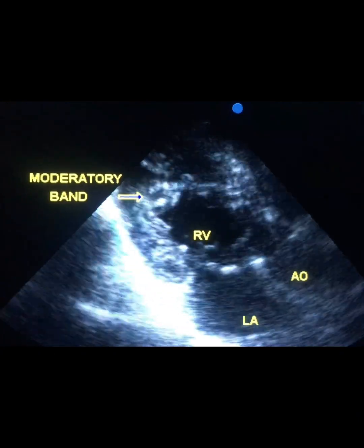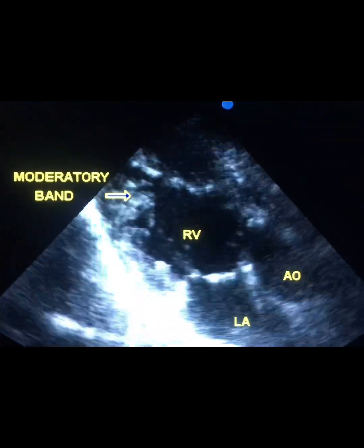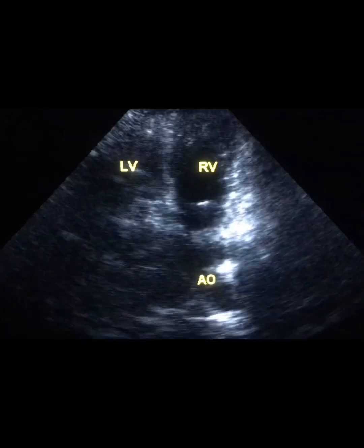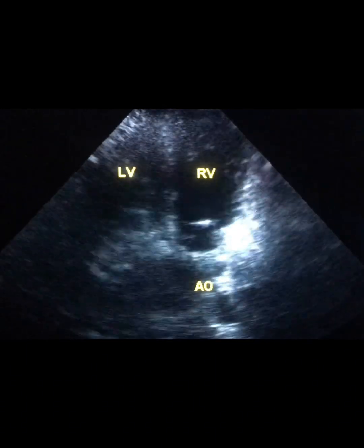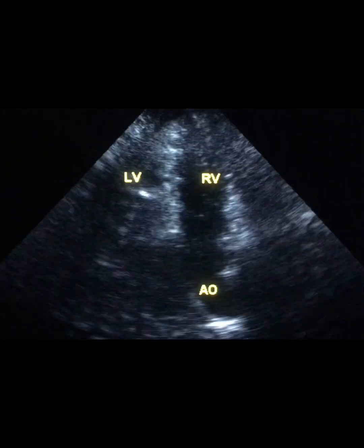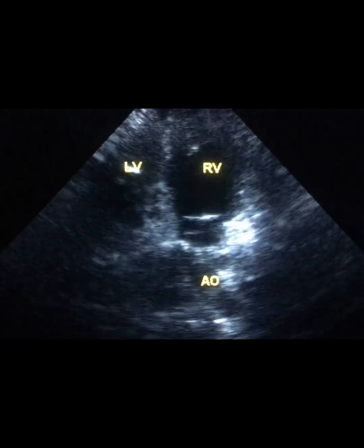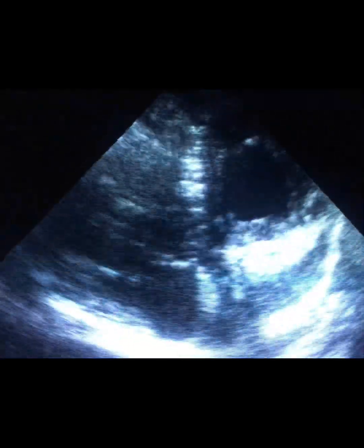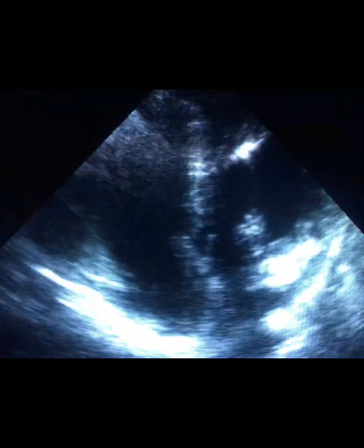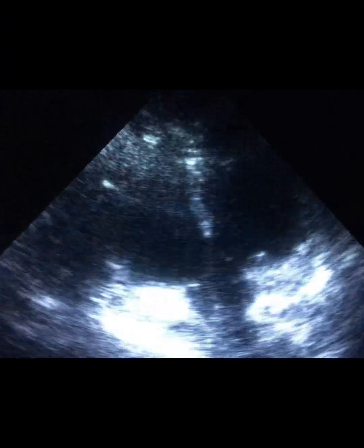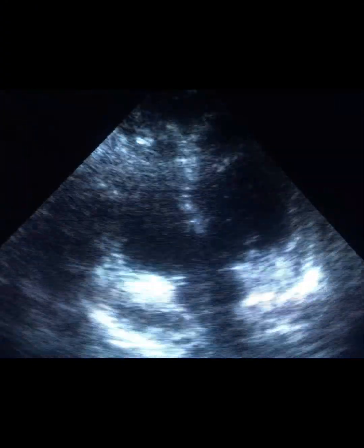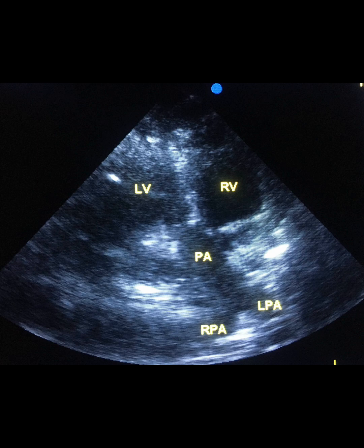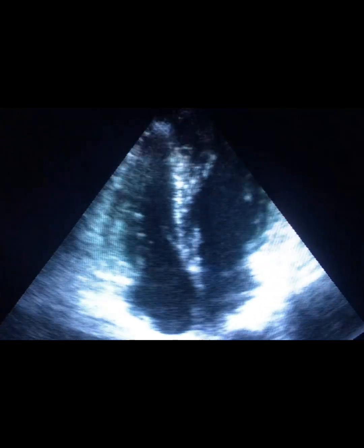Now, what is the arrangement of the great vessels? The aorta is a little curved without branches, so this vessel which comes from the RV is the aorta. The pulmonary artery divides into two branches, so this vessel which comes from the LV is the pulmonary artery.